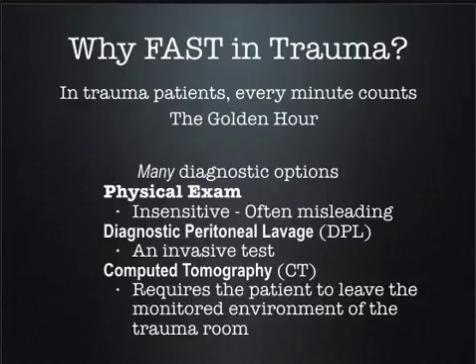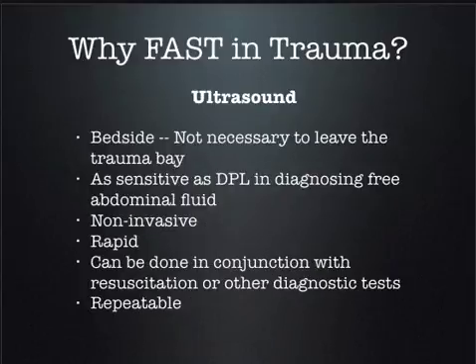It's a long ways away from the ED. And if you've got a sick patient, you really don't want them to be away from you or your monitors or being able to treat them. So you don't really want to send sick patients out of the ED without being prepared. So ultrasound helps you because it's done bedside. You don't have to send the patient out of the trauma bed. You don't have to get them away from all of your equipment. So they are where you are, and that is good.